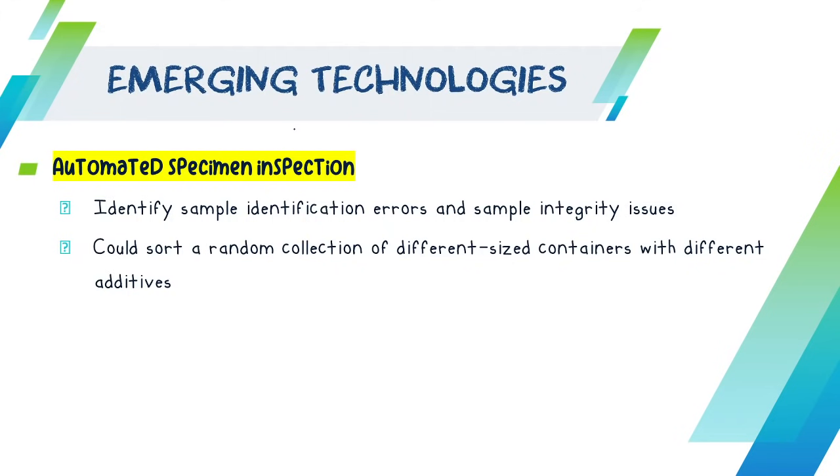Now, in a machine, whenever you place different size na tubes, actually ginasort, kita mismo ang nagasort. And gina-input nato na siya properly pod sa system sa computer na kunwari kani si sample number 9, butang ninyo sa rack, small na tube ni siya and all. But with automated specimen inspection, especially if you have a total laboratory automation na system gyud sa inyuhang laboratory, pati pag-sort out sa specimen, kanina siya ang ginamina. Even pag-sorting, kay kabalo na ang inyuhang auto-analyzer na kaning gamay, ato ni siyang ibutang tanan gamay diri sa isa ka rack, tanan na kaning tanan na red top, tanan na lavender top, and such.